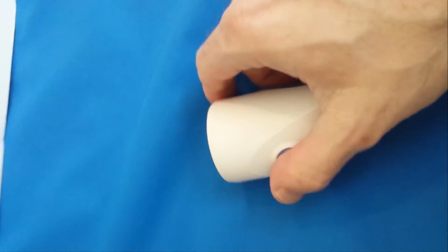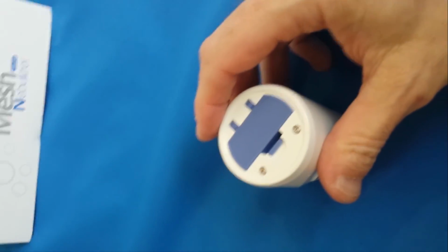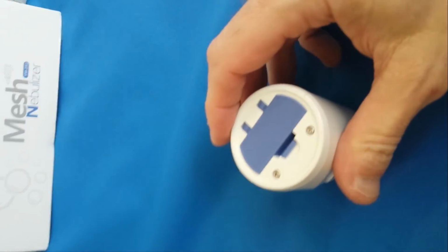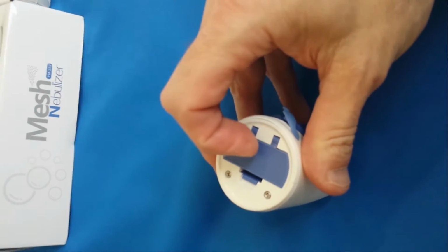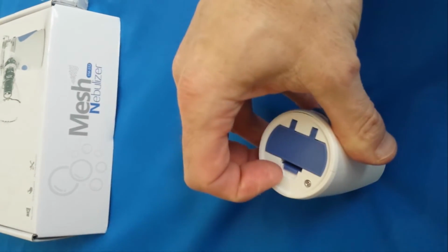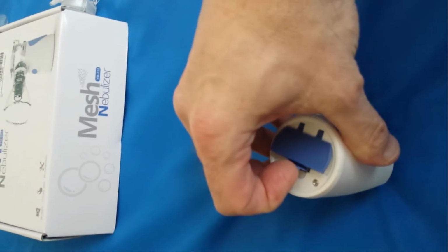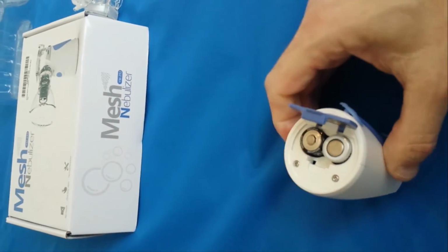Now the batteries took me a little bit to figure out how to put in, primarily because I'm vision impaired. But to put batteries in, you kind of put your finger right here, and there's that little clip. So you push that clip inwards, and then this comes up gently.